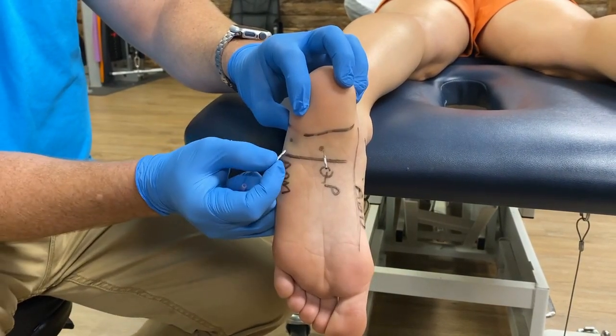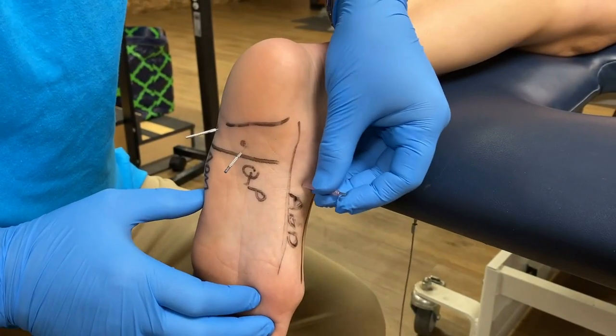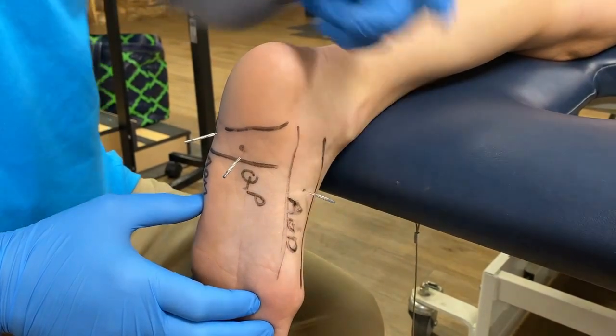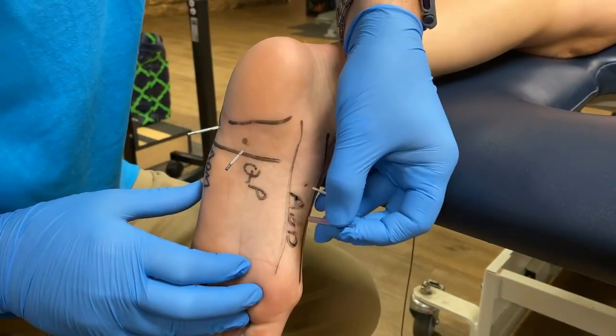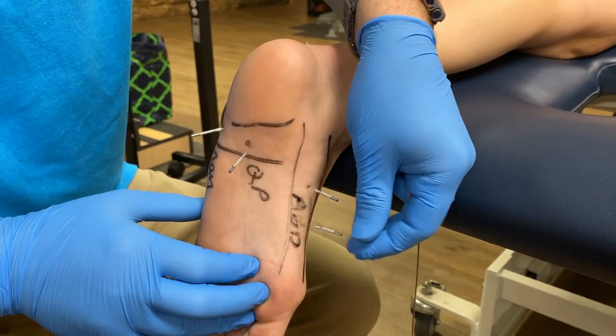For the abductor digiti minimi, it's the same kind of technique — with a 15 or 30-millimeter needle, you'll send it up towards the lateral calcaneal tubercle. For the abductor hallucis, we're only going to use a 15-millimeter needle because the muscle is superficial and we don't want to go too deep. Remember, directly underneath the muscle is the medial plantar nerve, artery, and vein, so a 15-millimeter superficial technique is used here — this muscle will be the first thing under the skin in this region.